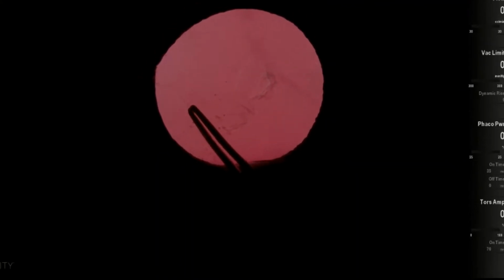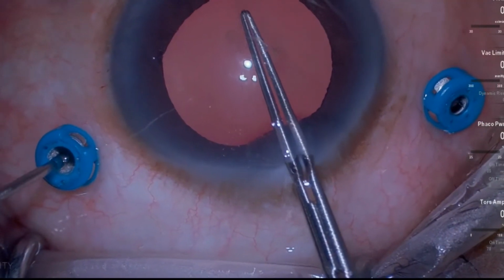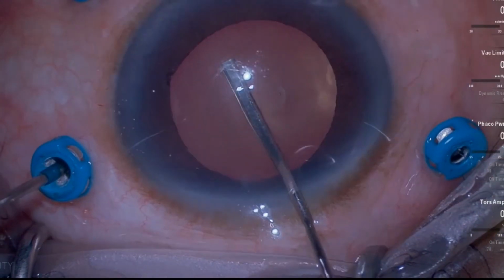One major advantage of using a light pipe as opposed to a chandelier for retroillumination is that an experienced surgeon has real-time control of the positioning of his light source at all times throughout the cataract surgery. The obvious disadvantage of using a light pipe is that the surgeon must perform the surgery single-handed as long as he or she plans to maintain the retroillumination.